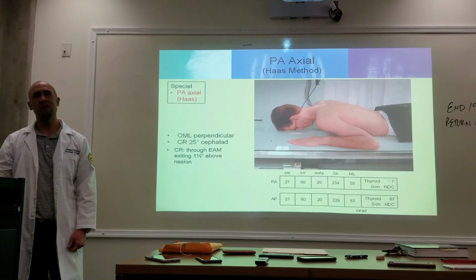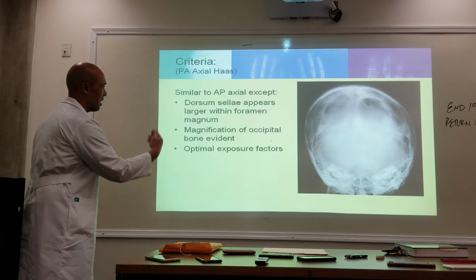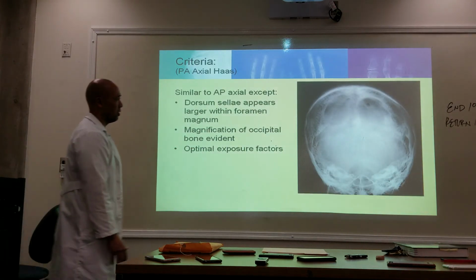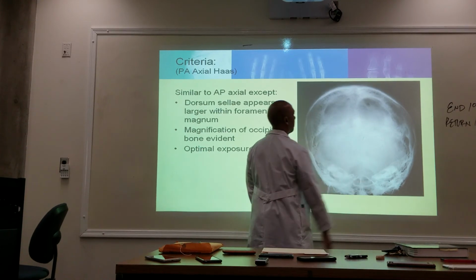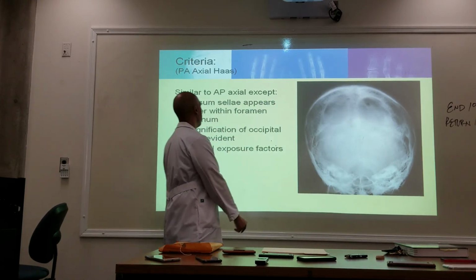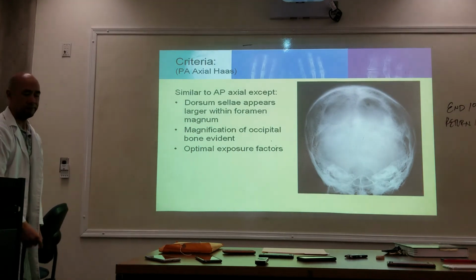Have you ever heard anybody refer to the occipital as the occipit? Have you guys ever heard that before? Okay, you may hear that out in the field. I've heard it a lot when I was a tech. They refer to it as the occipit instead of occipital. Okay, so it looks just like the Towne's. So we are looking at the occipital bone, but it's magnified.